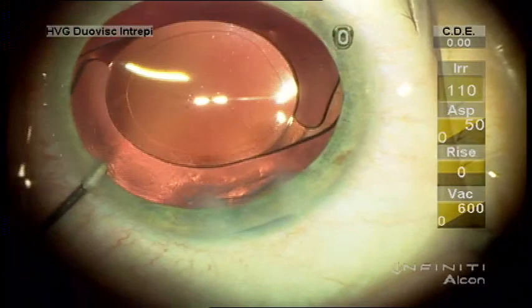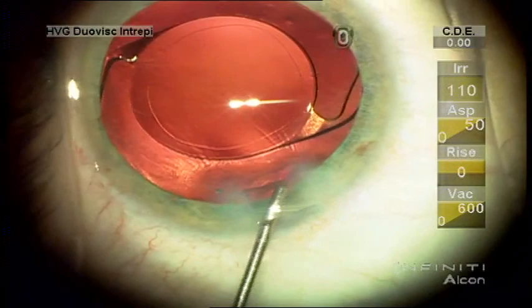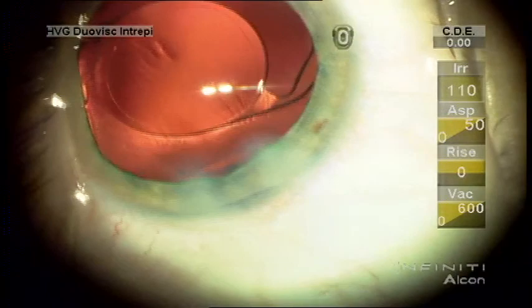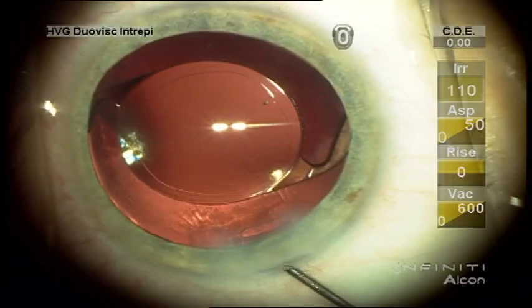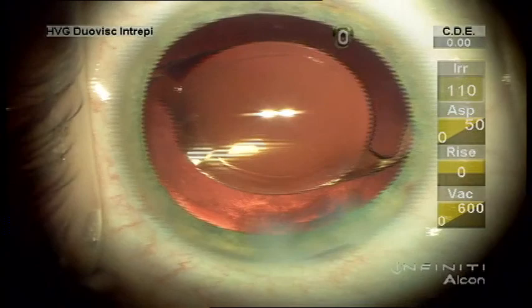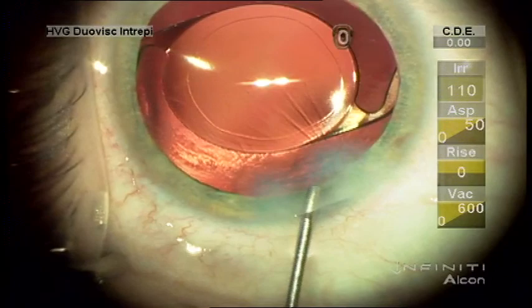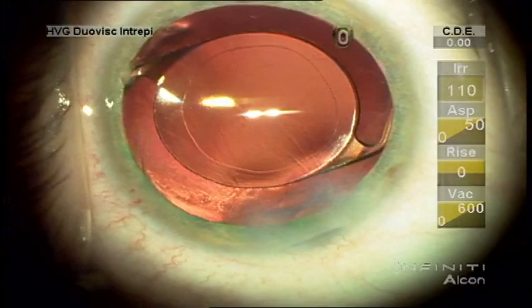So now the wounds are hydrated, or at least the tissue in the wounds is hydrated. That's to induce or create a bit of swelling in the corneal tissue that swells the wound shut. And also, as the chamber is reformed by adjusting pressure, the wounds will tend to act like one-way valves. Once the wounds have started to seal, the next step is the insertion of antibiotics. And we're not quite there yet.